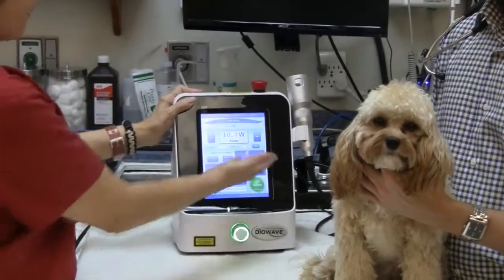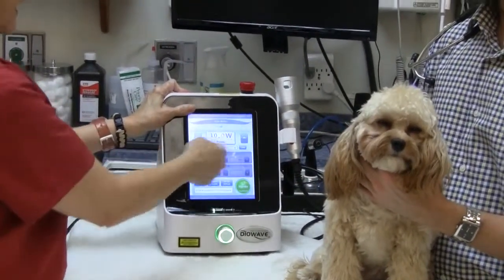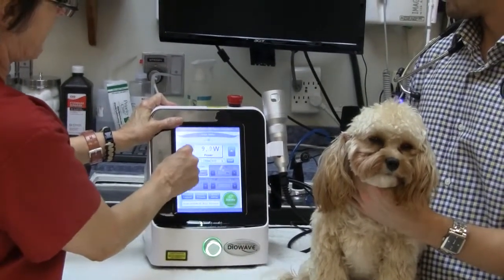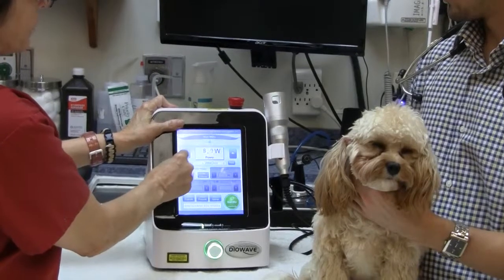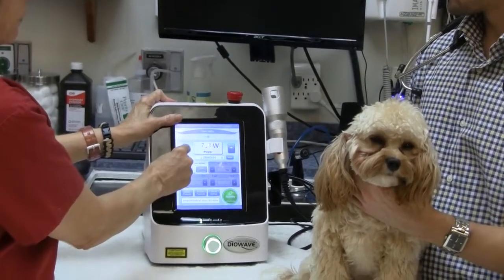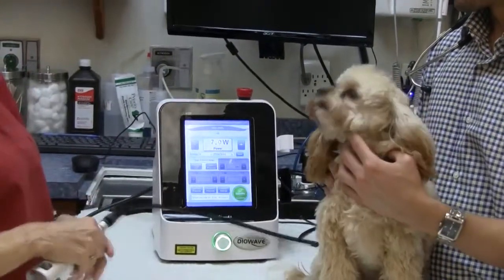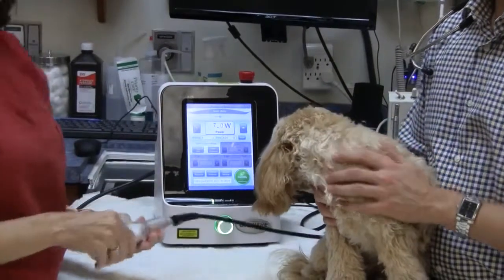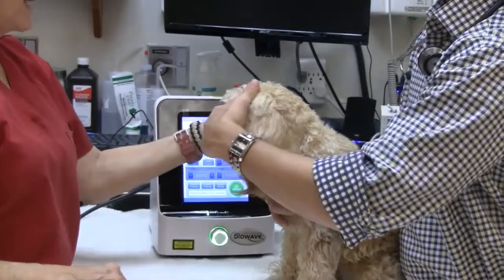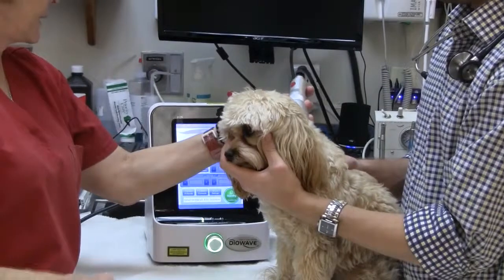If you don't feel comfortable with that wattage, because let's say she was a black dog, I wouldn't laser her at 10 watts because it would burn her, because a black dog gets hotter. So you can still drop the wattage down to whatever you feel comfortable doing. The higher the wattage, sometimes you don't have to laser as long. Most treatments are 10 minutes long. But if it's a white dog and you want to laser at a higher wattage, you don't have to laser for the full 10 minutes.